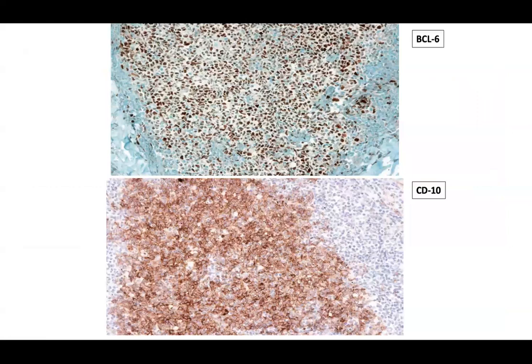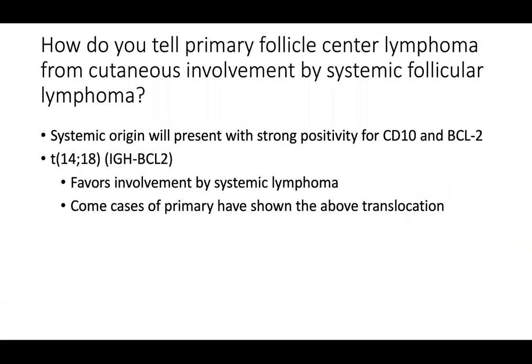So here you see the BCL6 expression. You can also see a lot of CD10 expression as well. And the CD10 expression, if it's high, can make you think about potentially a systemic follicular cell lymphoma that's involving the skin. So we'll get to that.